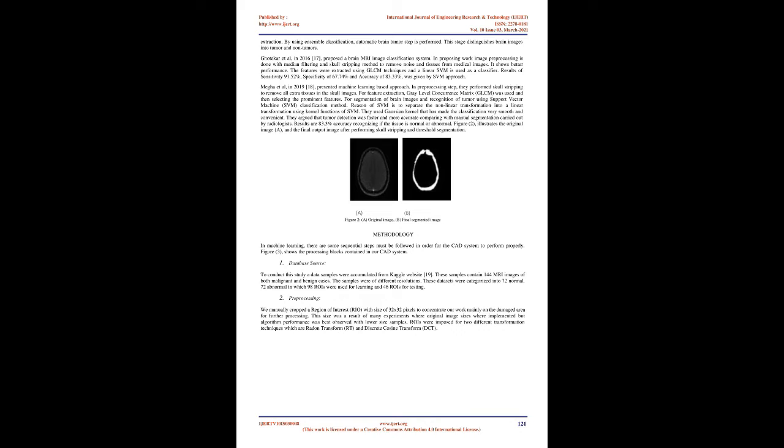Their work contains 4 steps. Step 1. Brain MRI database acquisition used a dataset of 66 brain MRIs in 4 classes, e.g. normal, glioblastoma, sarcoma and metastatic bronchogenic carcinoma tumors. All the brain MRIs were in axial plane, T2 weighted and 256 by 256 pixels.